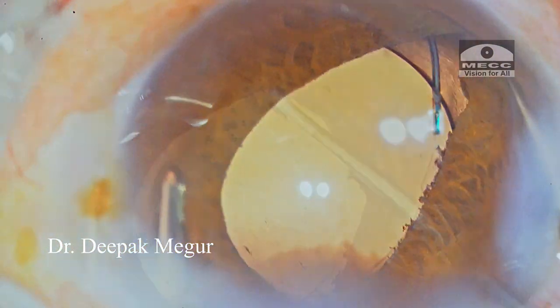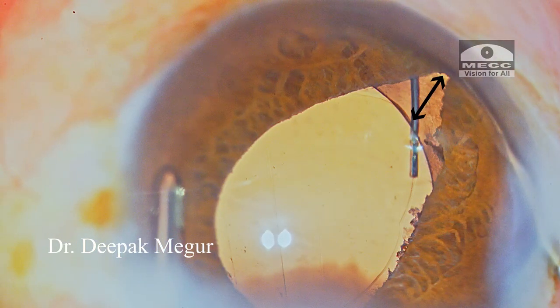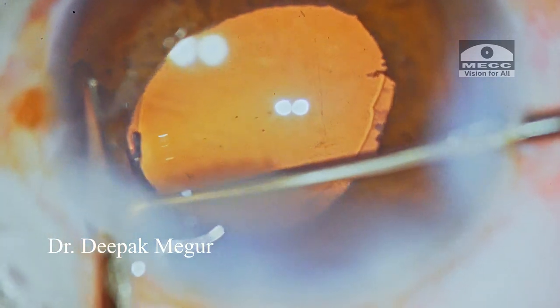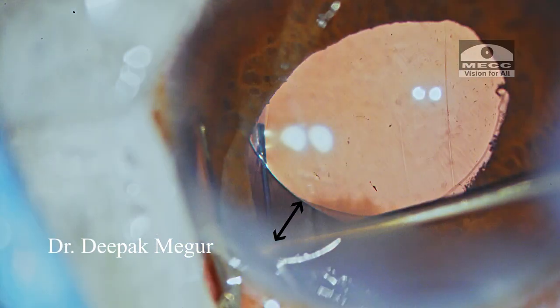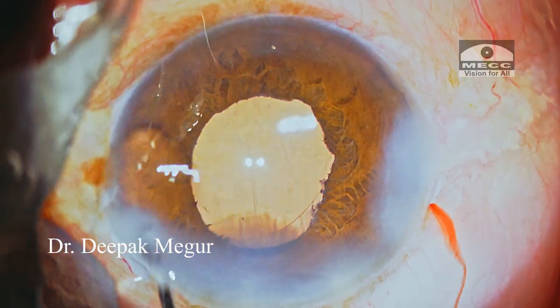Optic capture is confirmed by ovalization of the rhexis. I retract the iris using the Y-hook and optic capture is confirmed at both ends. The IOL is nicely trapped in between the rhexis margins. The wounds are then hydrated — and that's it, the case is done.